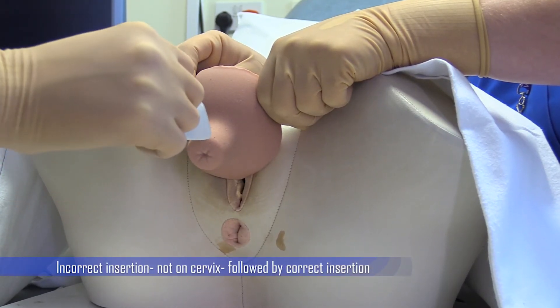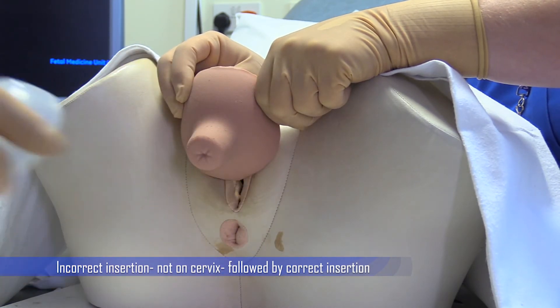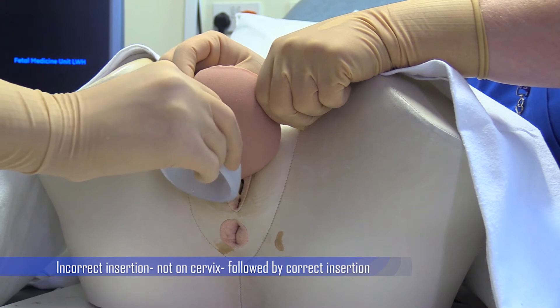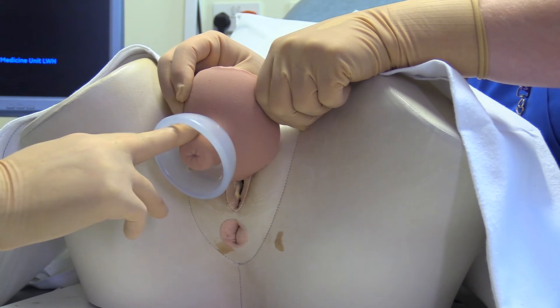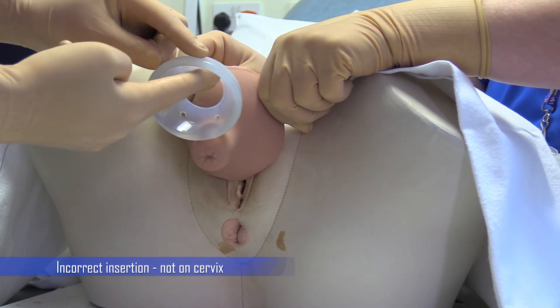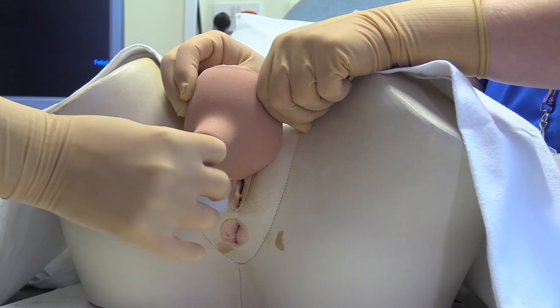When inserting the pessary, it is possible to incorrectly flip the dome of the pessary upside down. The pessary should be removed and replaced correctly. It is also possible to advance the pessary insufficiently into the vagina so that it does not cover the cervix. This should be noted because the cervix would not be palpated within the pessary, and the pessary should be removed and replaced correctly.